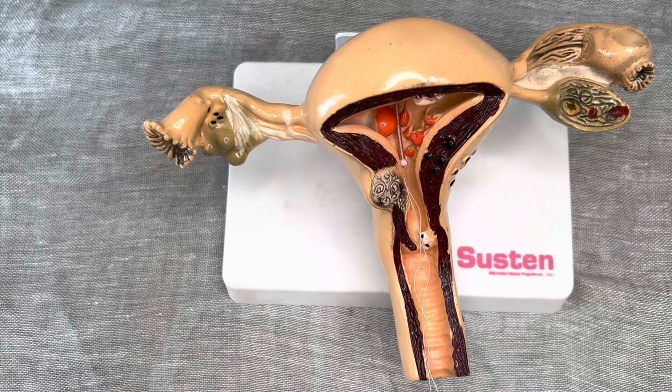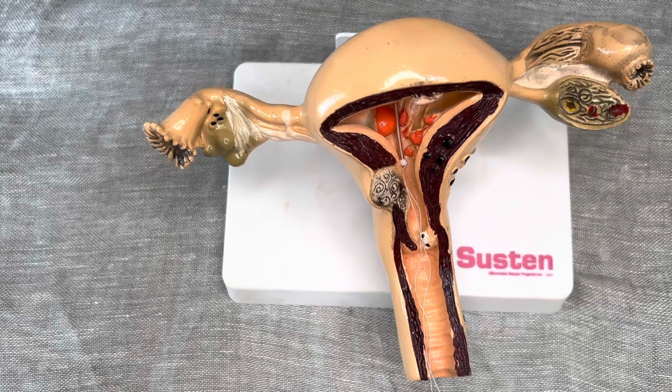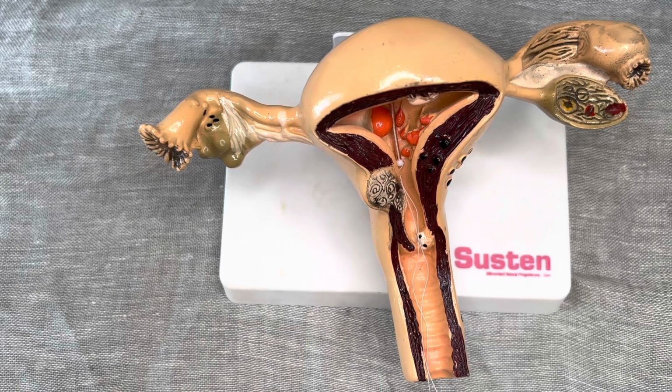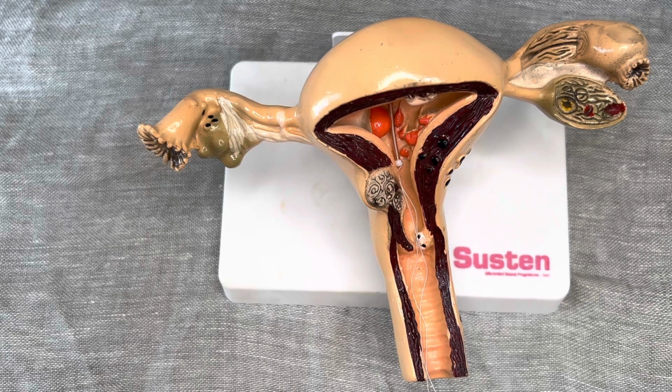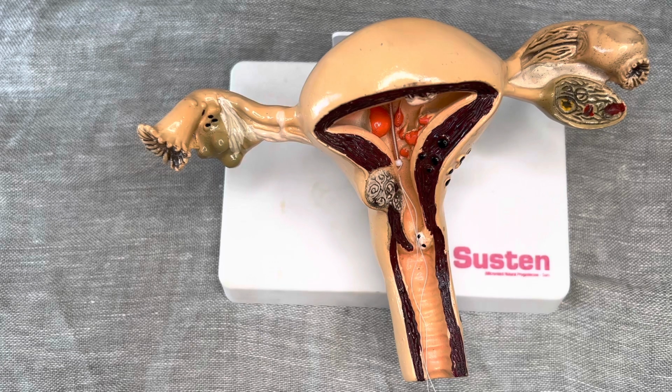See how I told you it's very, very simple. And I'm hoping that you've enjoyed this video today on how to actually insert an IUCD. And for removal, it's as equally as easy as insertion. As I said earlier, the procedure is not painful. It is a bit of a discomfort. And some people tend to say they notice some spotting maybe after the procedure, but that's about it. It's supposed to be very painless, just a bit of some discomfort.